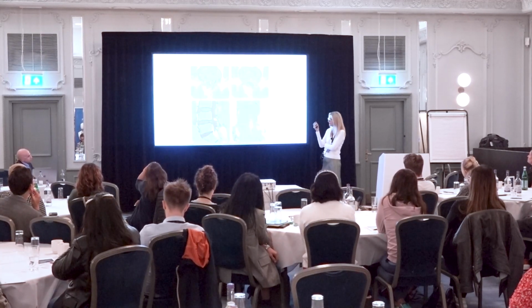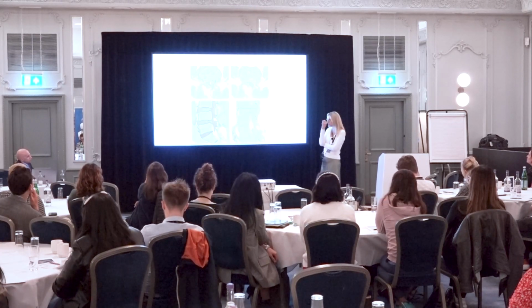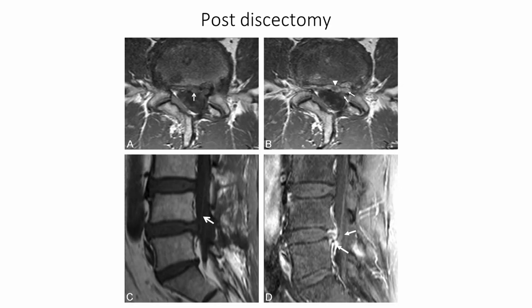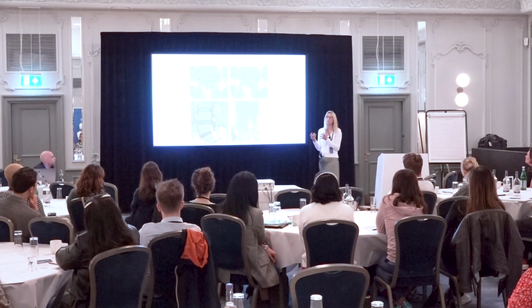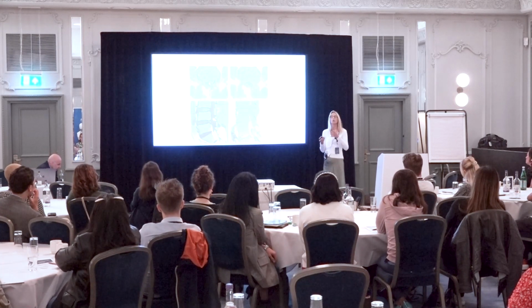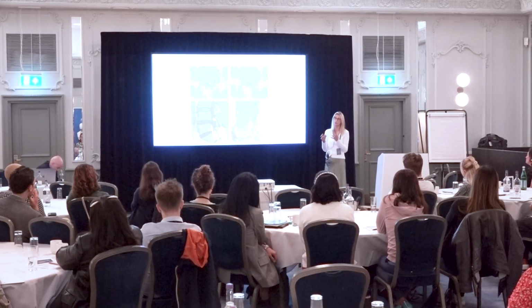Now, a difficult area of imaging for neurosurgeons and neuroradiologists is the postoperative spine, because the surgeons will go in and they'll do a discectomy, and the patient will get much better. But sometimes, either very shortly after surgery or at a subacute phase, they come back with recurrent symptoms. And then we often image, trying to work out, is this post-operative change, or is it recurrent disc, or is it hematoma, etc. So these are the things we're looking for.